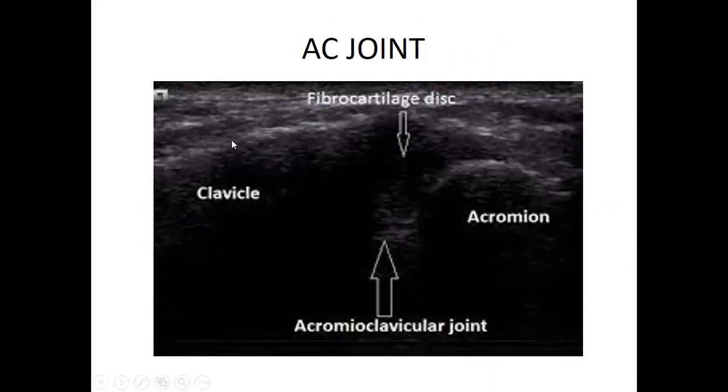Like I mentioned, on the proximal portion, this is the bone cortex of the clavicle, okay? This is the clavicle. Remember, there are muscles around here, so we are trying to pick the most relevant information. So this is the clavicle. When it comes here, there is a disruption here. This is a fibrocartilage disc. This is how a cartilage will appear. And then you've got the acromion just within there. And then the humerus is around there. So within here, this is the acromioclavicular joint.